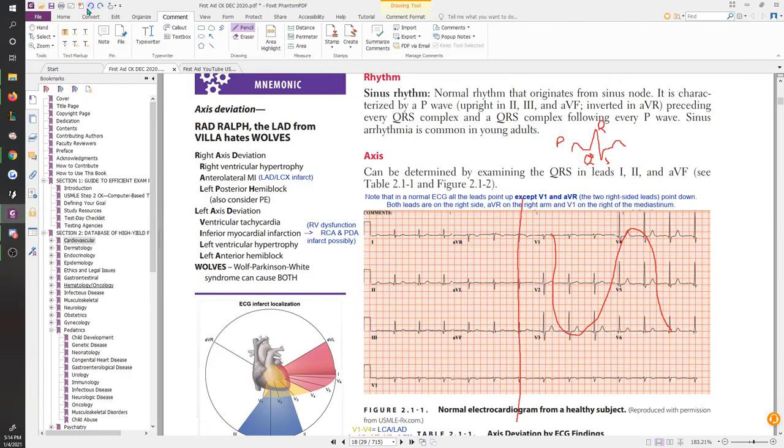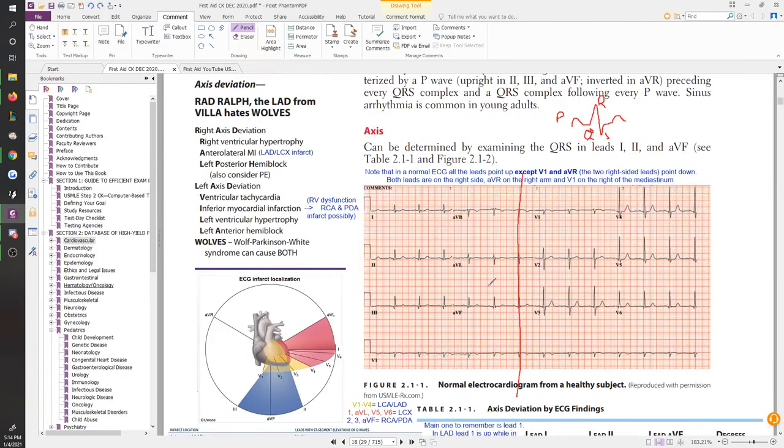If you have a patient where you cannot see the R wave progression, then you can already see where the leads are here. Based off of where the R wave progression is messed up, it's going to be one of those leads, and then, of course, respectively, one of those blood vessels that are messed up, and that's how you'll pick your answer. Of course, there might be other things involved too. We haven't looked at everything yet, but that's the general beginning, right? So this is basically how to read ECGs.